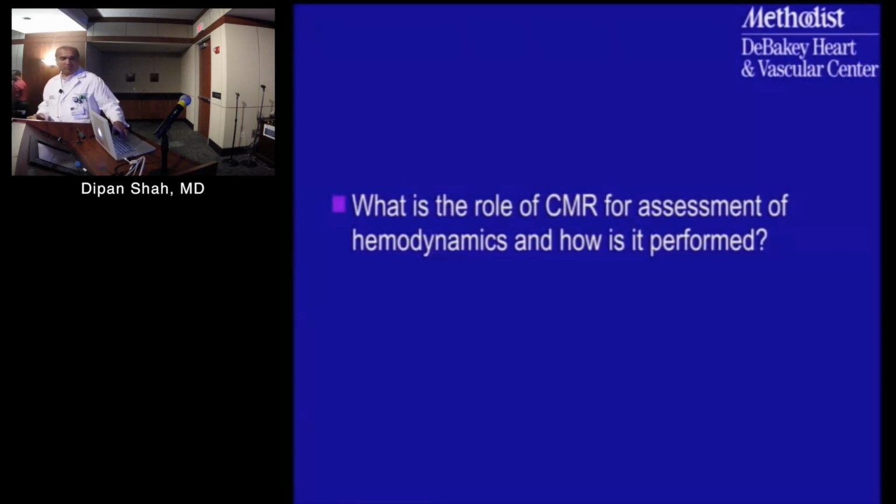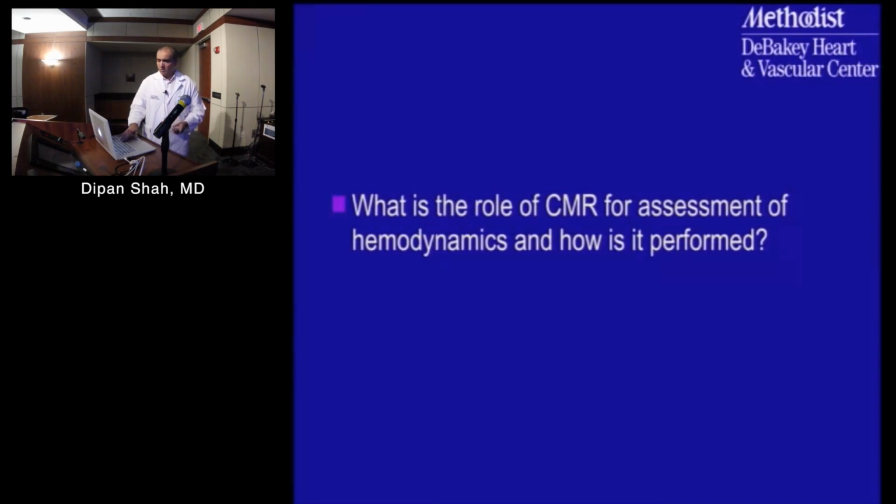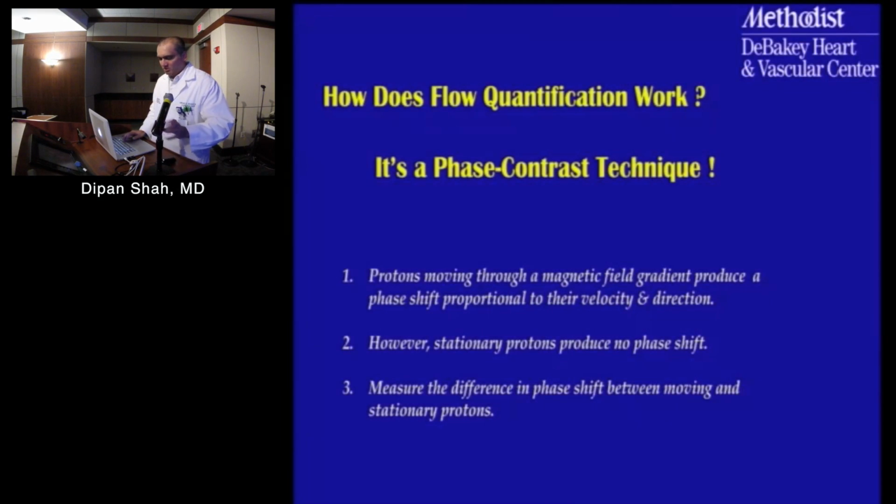So I'm going to turn a little bit now to CMR and how it can be useful for hemodynamic assessment. So first thing I want to do is talk a little bit about what is the technique that we utilize. And basically it's a technique called phase contrast CMR. And let me just walk you through some of the basics behind it.